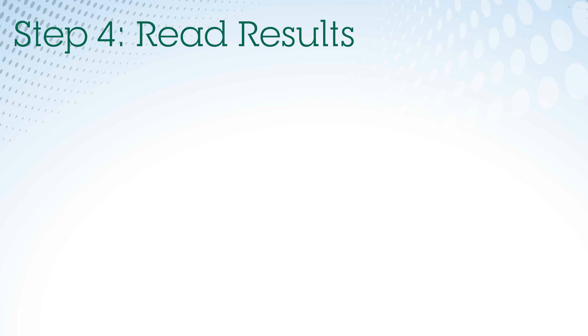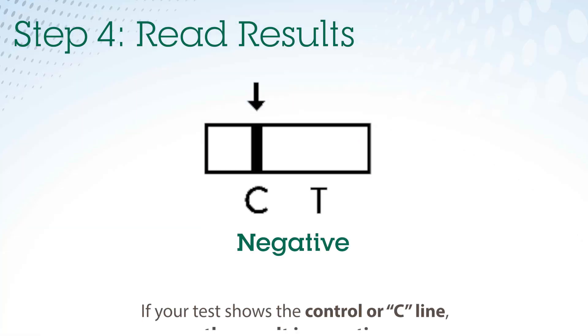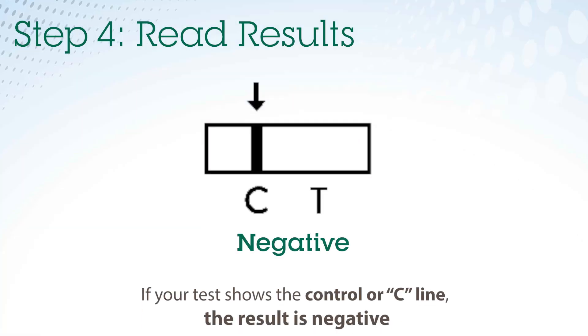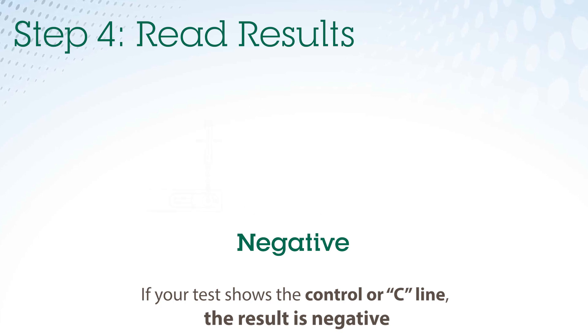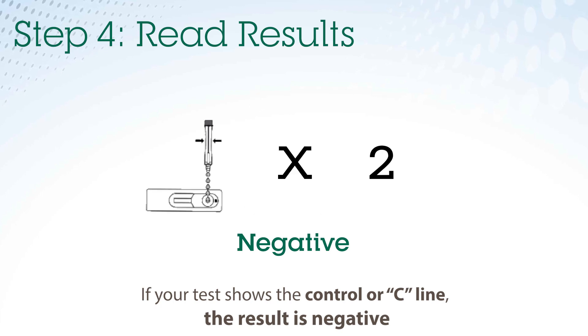Step 4: Read your results. If your test only shows the control or C line, that means the result is negative. Continue to monitor for symptoms and test again if needed.